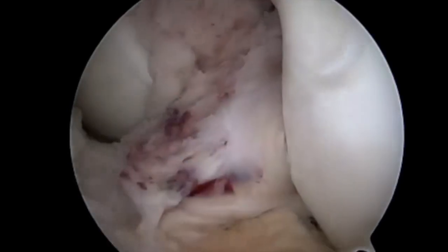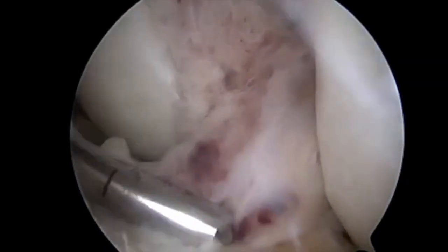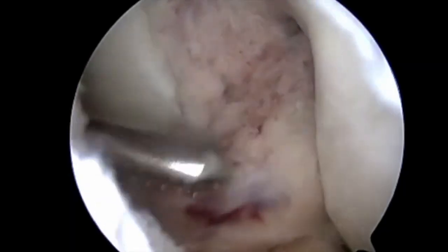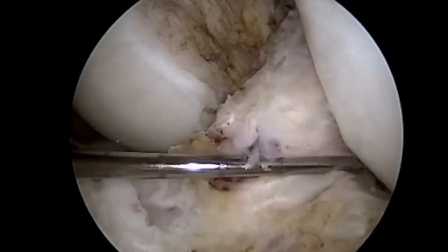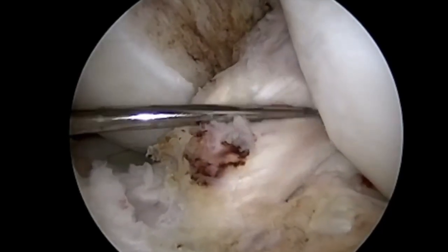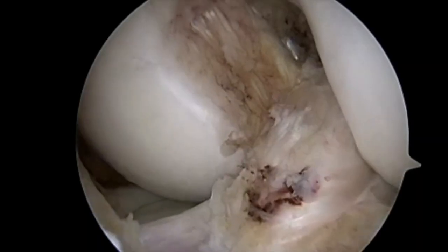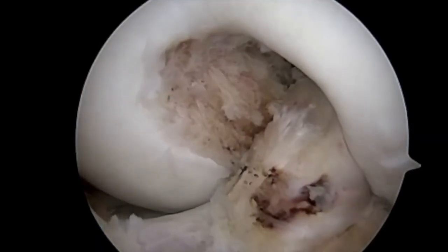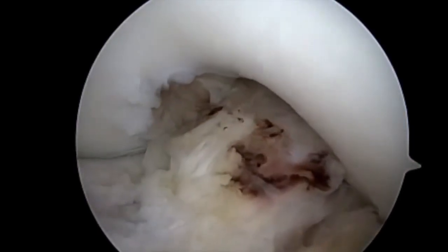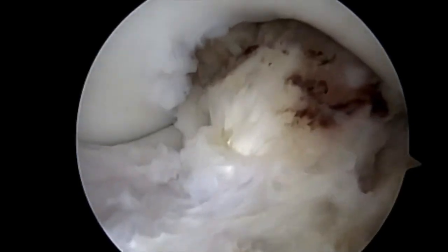This involves debriding the suprapatellar pouch, medial and lateral gutters, and retropatellar space to complete the lysis of adhesions. The ACL graft can be visualized here, showing signs of appropriate healing and ligamentization. The Cyclops lesion has been completely removed. The knee is then ranged through range of motion in deep flexion and full extension to assure full range of motion can be achieved without any signs of soft tissue or graft impingement.